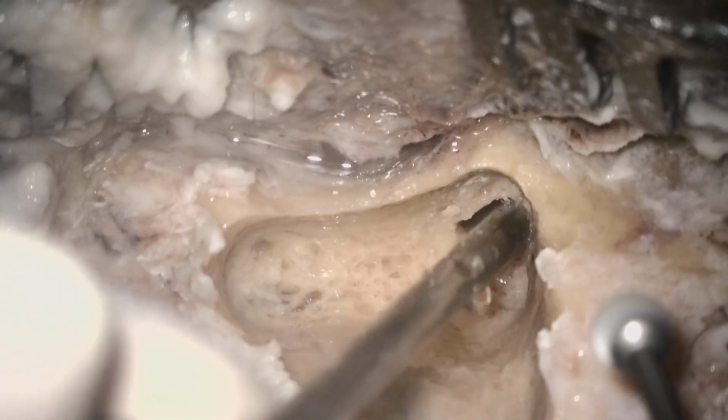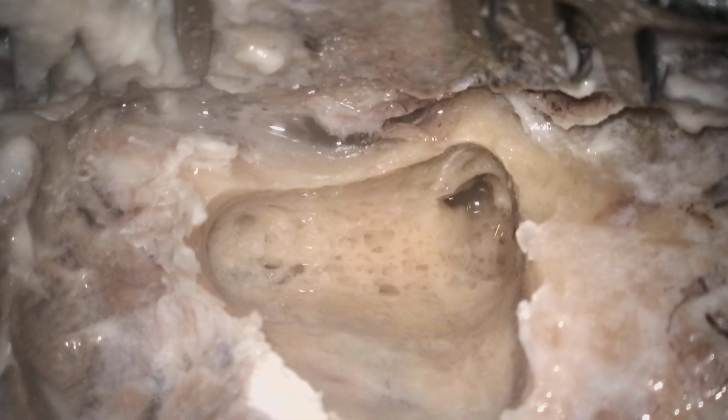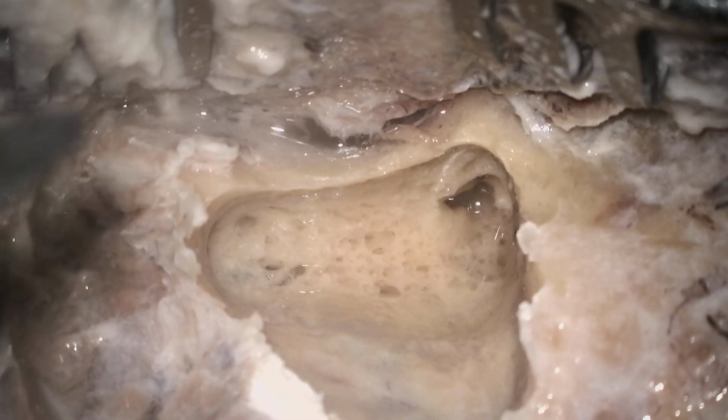Look, now give some water. You can just visualize a glimpse of the incus. Now you can visualize the incus, the short process on the body of the incus, and this is by the refraction of the water. Okay, look, this is the incus over there, and when I suck it, you cannot visualize it. So this is called the refraction test.